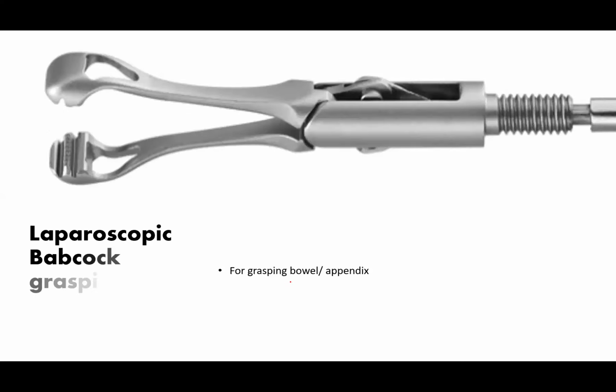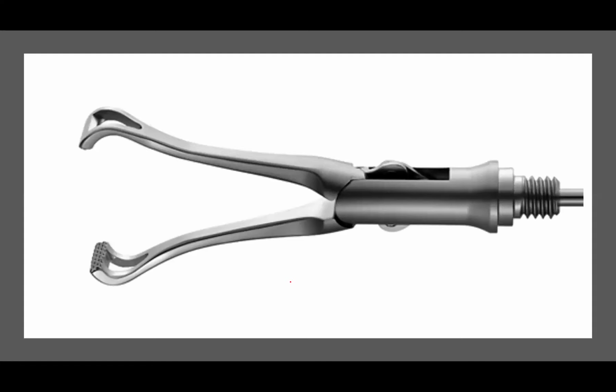Then the Babcock, laparoscopic Babcock grasping forceps, just like the normal Babcock for grasping bowel or appendix. Okay, this is also a Babcock tip.